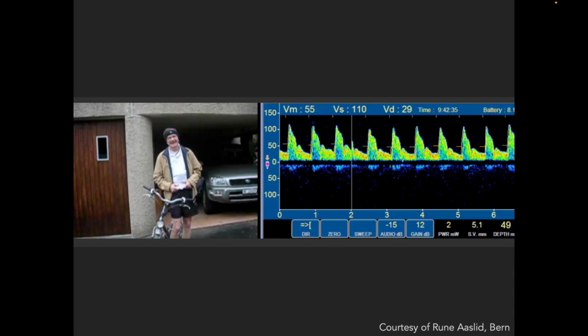You then can see easily the hemodynamic changes in the Doppler signal. The purpose of this movie is to illustrate that it is really possible to measure the TCD signal with an ambulatory device even while considerably moving around. When you advance to the next slide, the movie will start automatically.